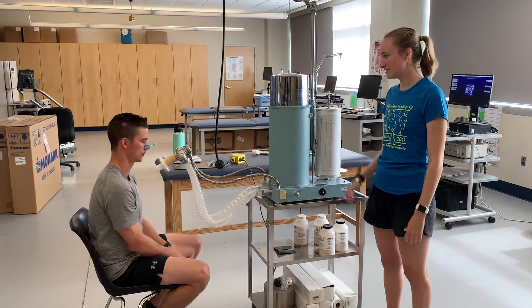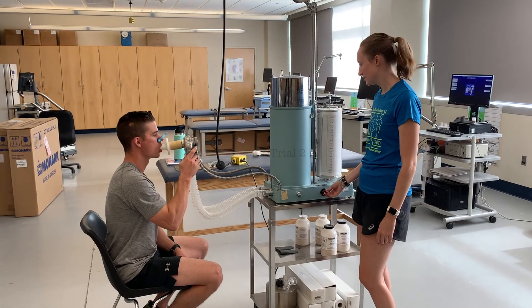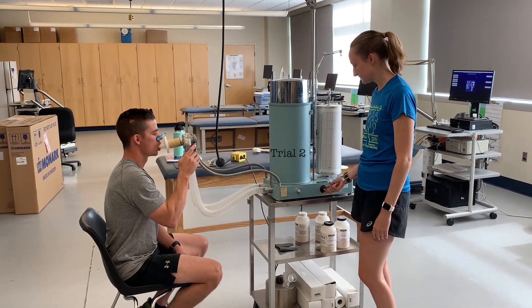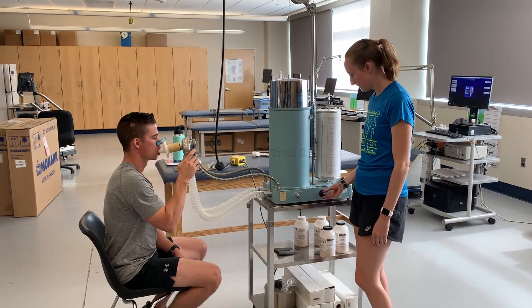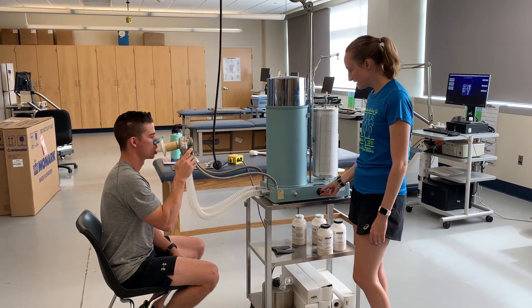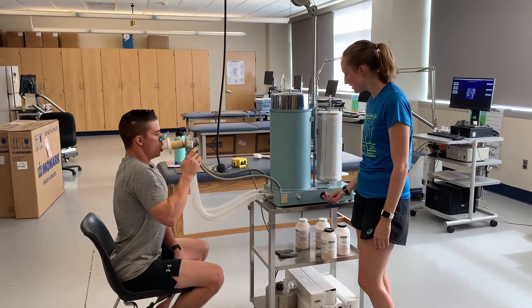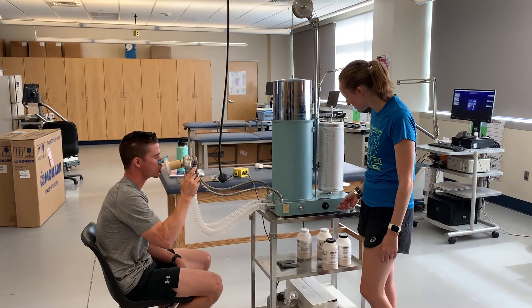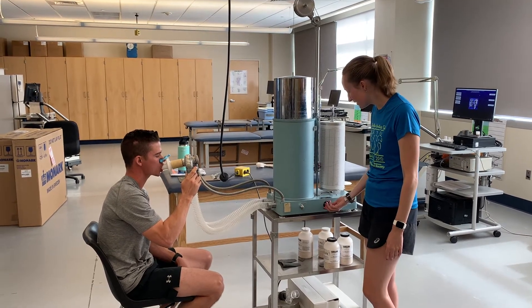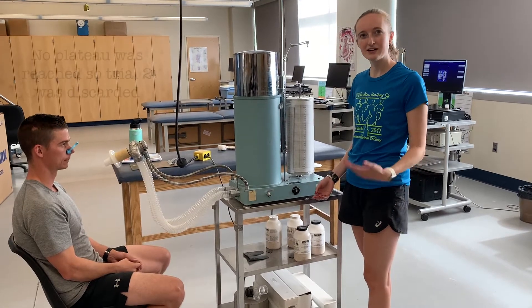Okay Ethan, ready to do one more? Whenever you're ready, go ahead and go on there and start those normal inhales and exhales. Whenever you're ready, fill your lungs all the way to the top and exhale — push all that air out, keep going, push, hold it. And you're good.